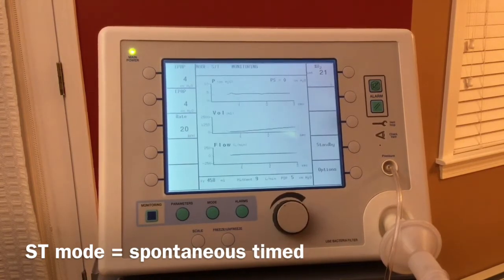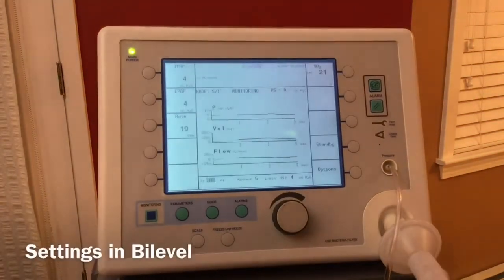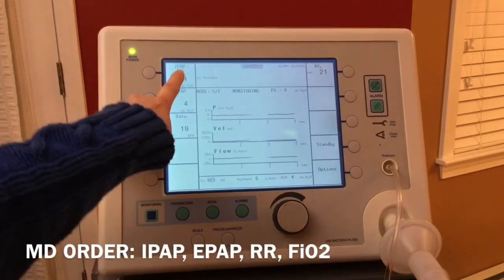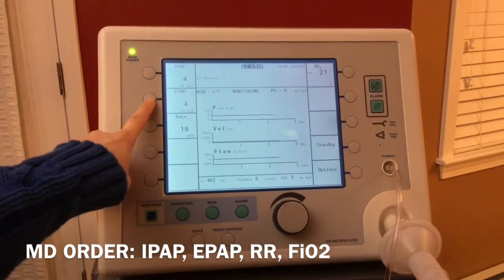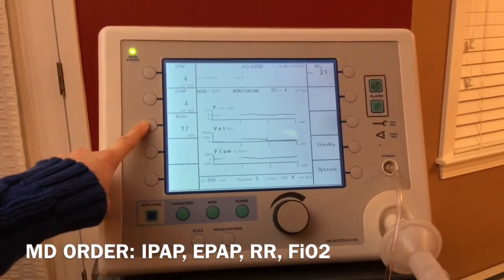But in all machines, you will have the mode either spontaneous timed or BiLevel. It'll have some nomenclature to it like that. And in that mode, when we're in BiLevel, you're going to have several settings. You're going to have an IPAP setting, the inspiratory pressure amount, the EPAP setting, the expiratory pressure amount. You'll have a respiratory rate that you set.